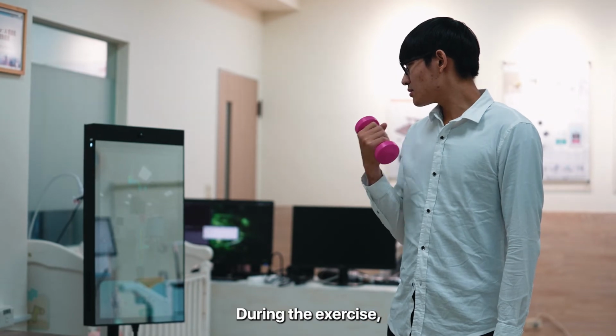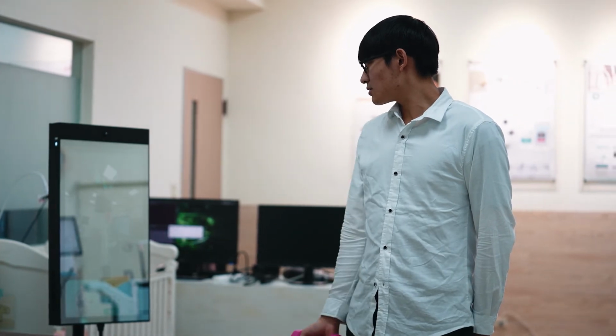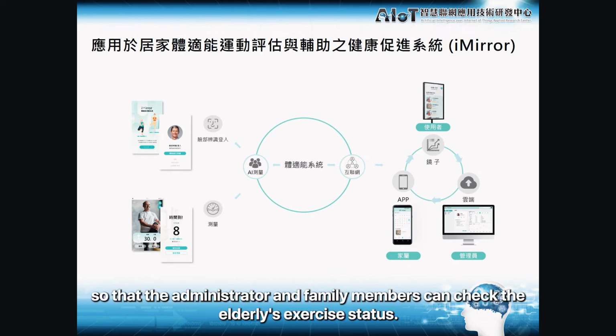During the exercise, the system will continuously detect changes in human posture to calculate the exercise standard. Finally, at the end of the exercise, upload the exercise data to the cloud management platform, and send the push notification to the mobile app, so that the administrator and family members can check the elderly's exercise status.